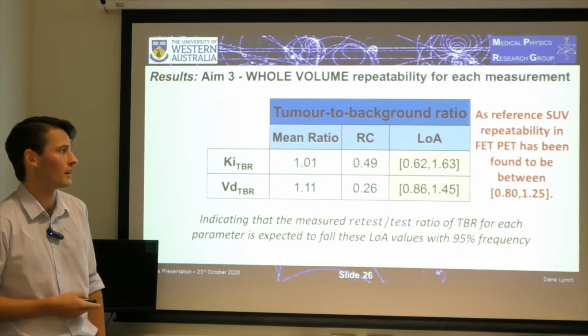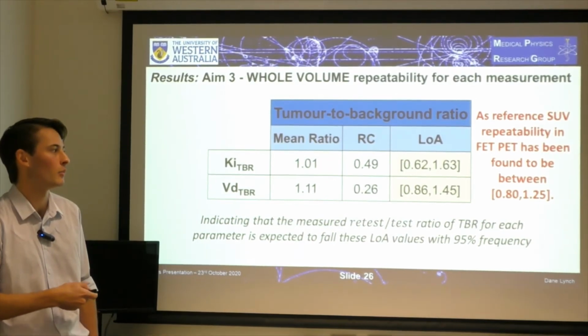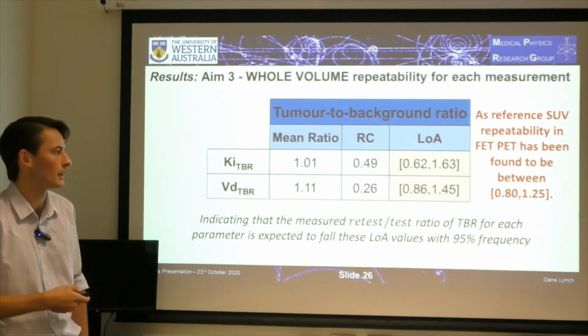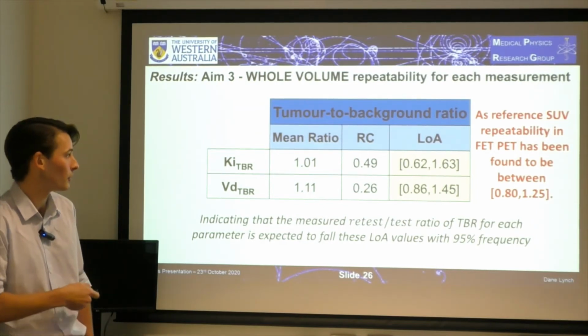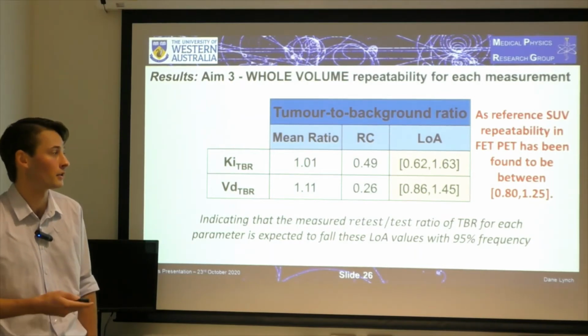As reference, standardised uptake value repeatability in FET PET has been found to be between about 0.8 and 1.25. So while this level of agreement is more narrow than these tumour to background levels of agreement, it is by a marginal amount.